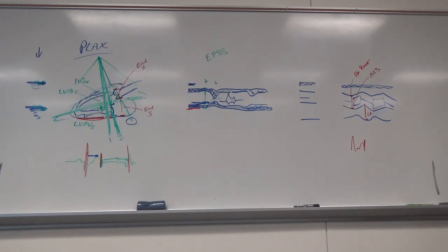That's our M modes of parasternal long axis. We haven't even left the first view yet. Isn't it great? Honestly, a lot of what we do is right off that very first view. The rest of it is not quite as bad.